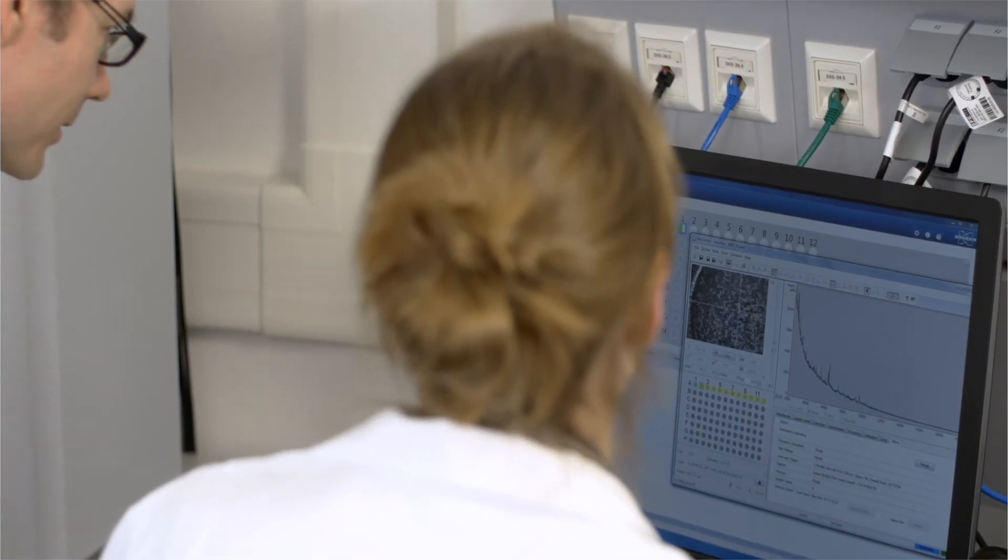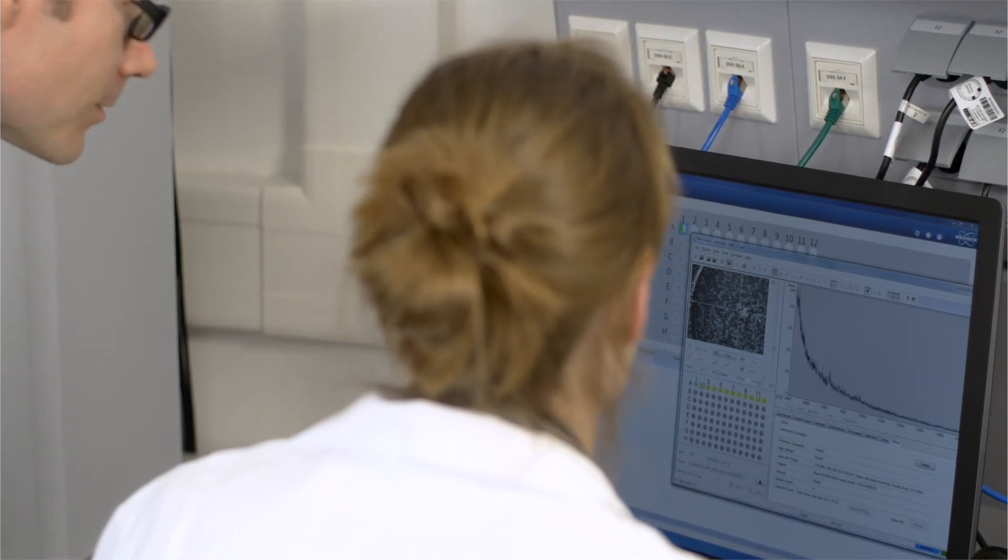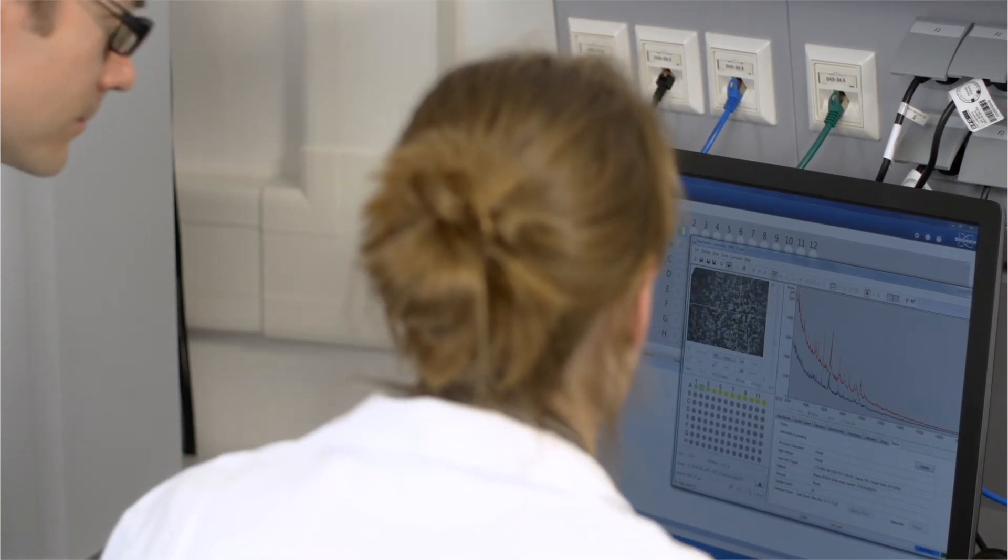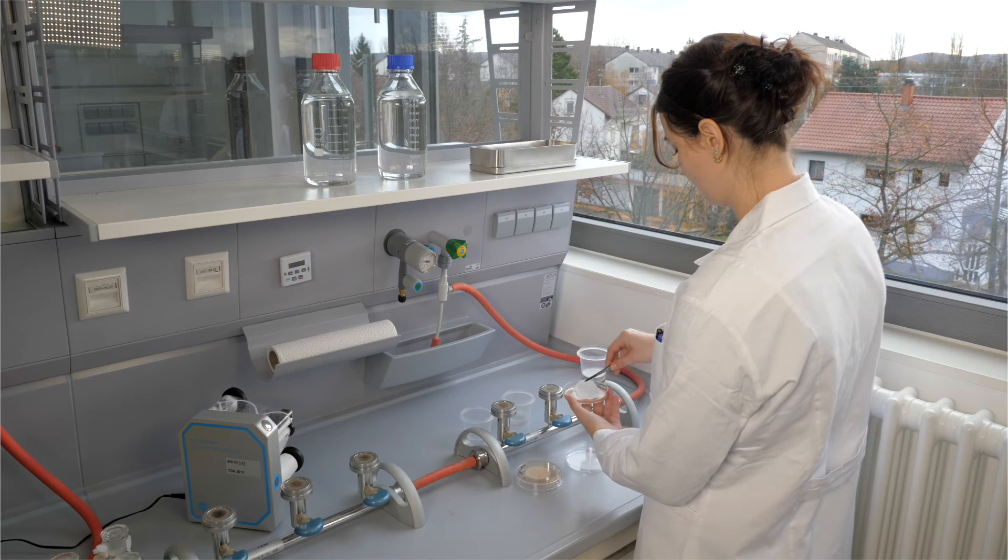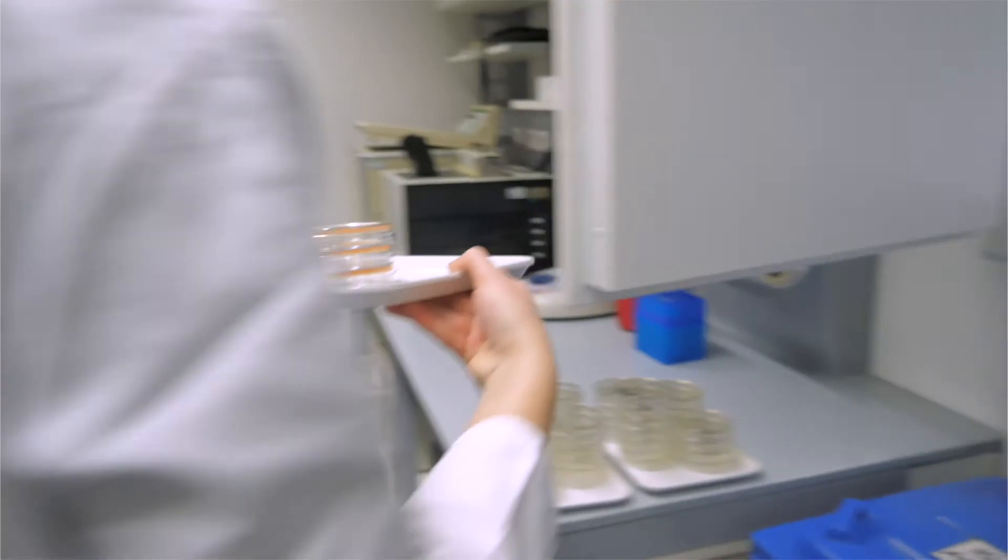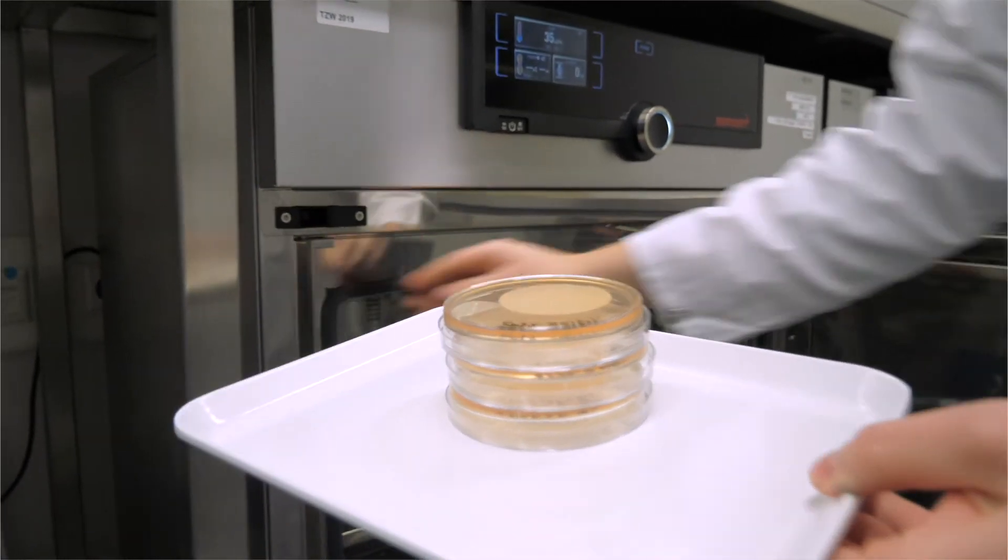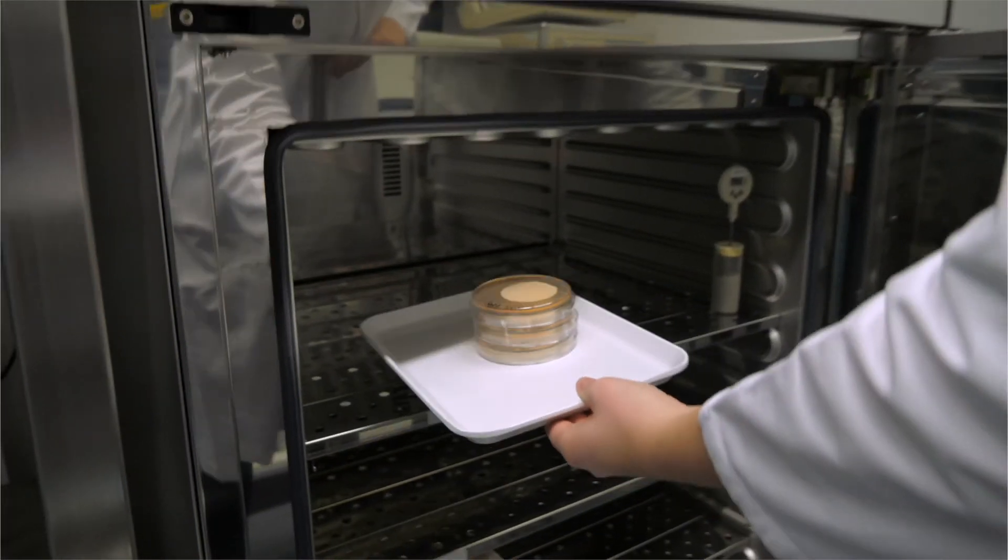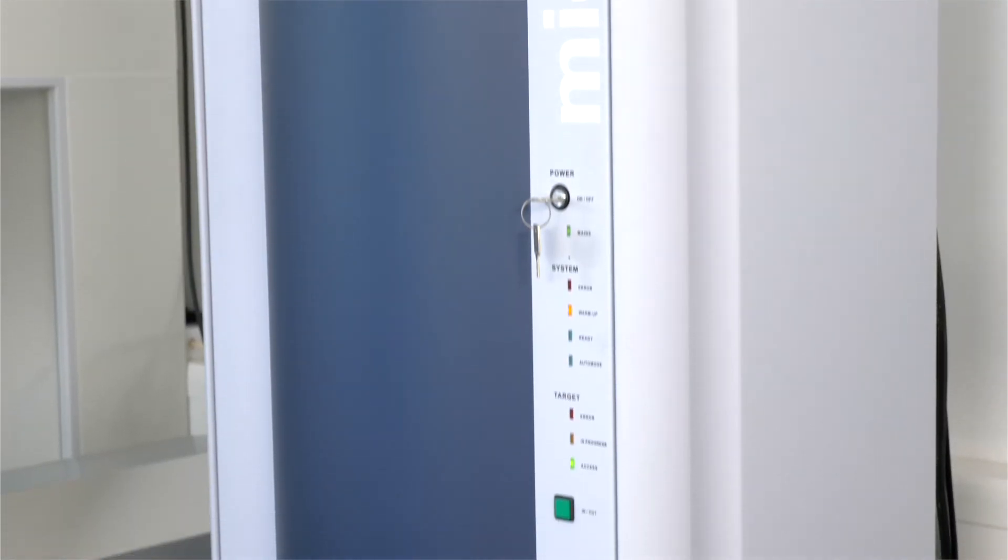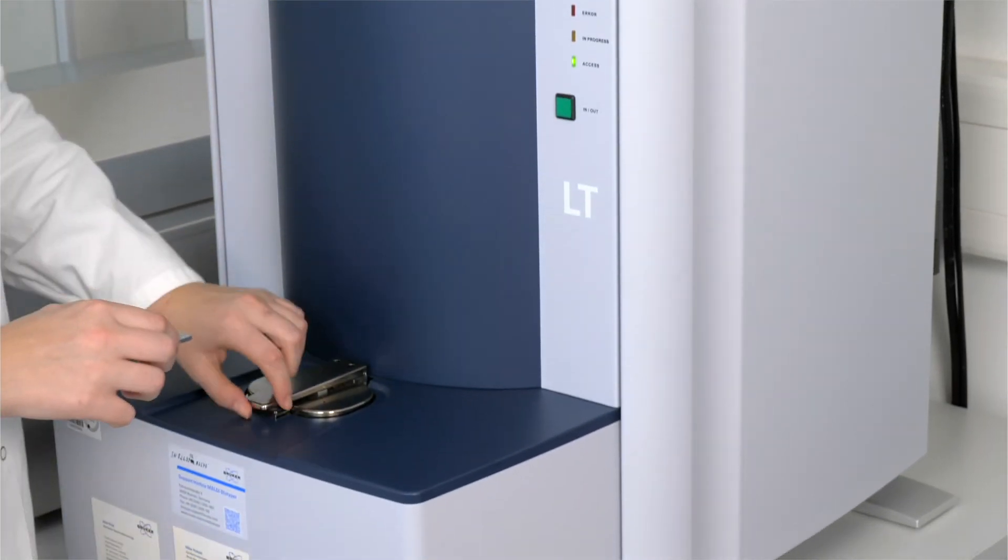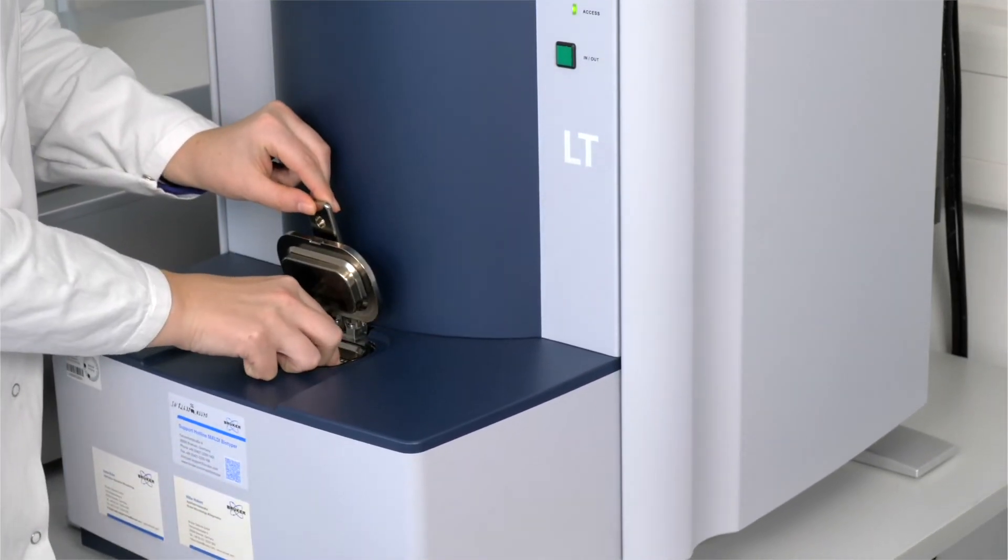The method enables the identification of bacteria isolates in less than an hour, a very short timeframe. If there are any enterococci in the water sample, bacteria colonies will grow on the filter. These colonies can then be identified directly in the MALDI-TOF mass spectrometer using the bacterial protein spectrum.